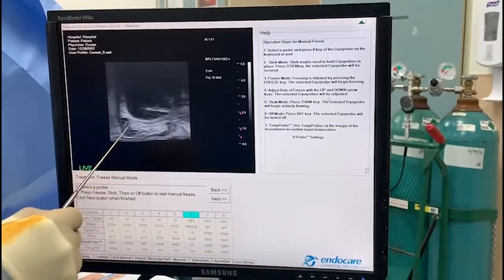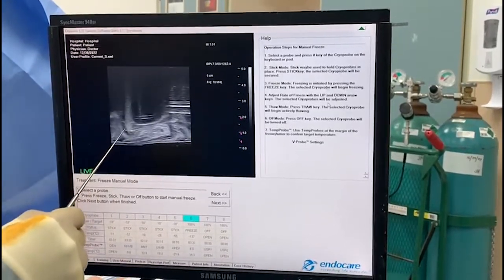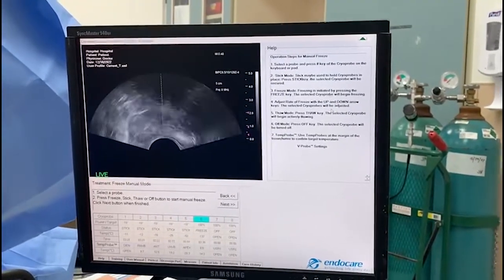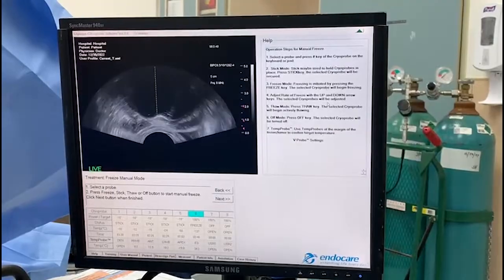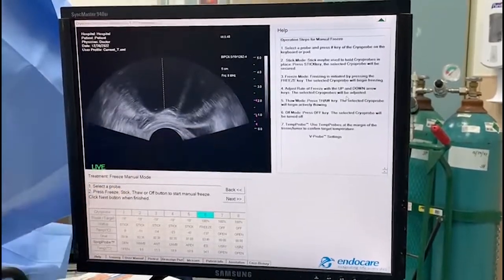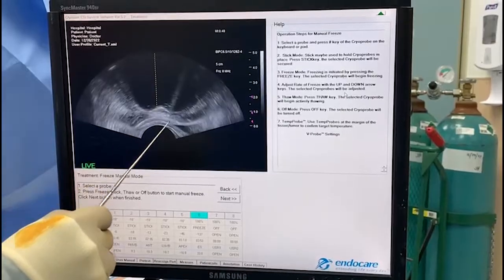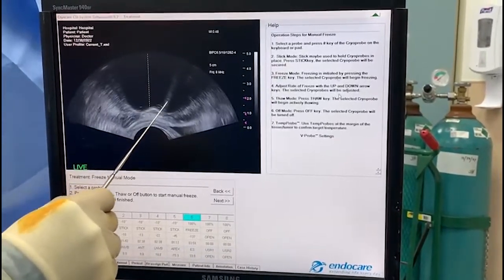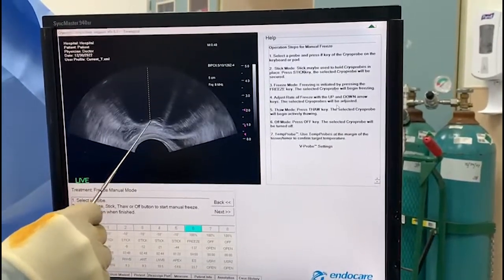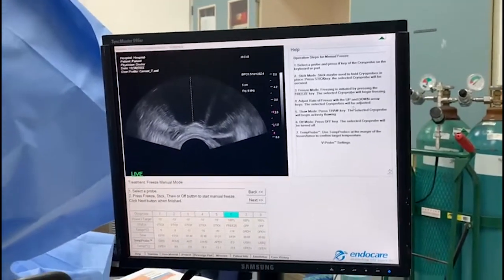We've got a great ice ball on the right side. Going to the left side — again, a very good ice ball. I've stopped the right side altogether and we're just driving the left so we can flatten this area in the middle sulcus between the two lobes of the prostate. Running only probe six at 100 right now to catch up and conjoin the two lobes, so there's no area untouched by the freeze.